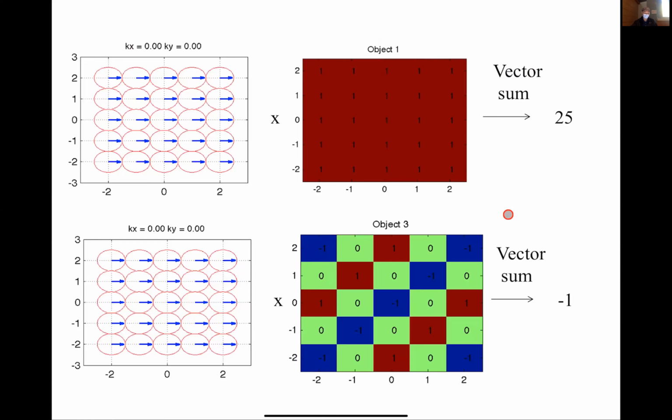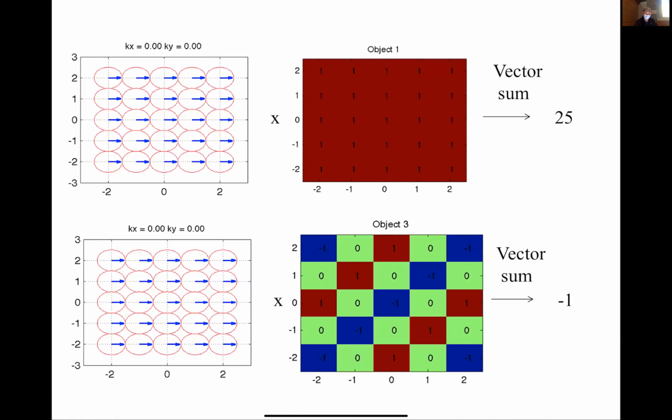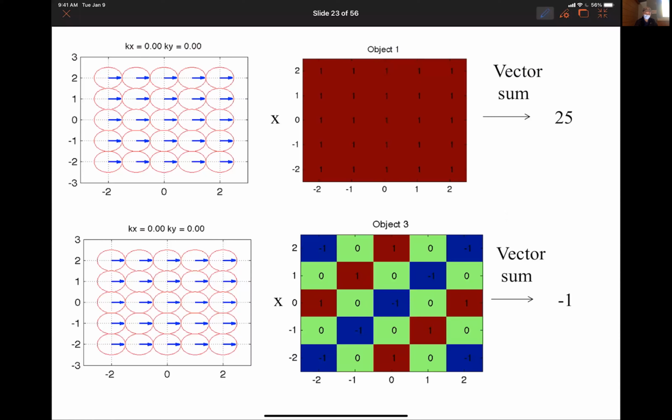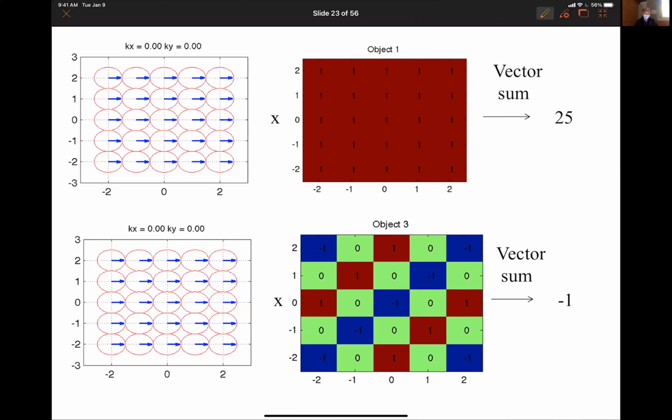So in this case, anywhere there's a -1, let me change my color here. The orange is best. Basically, wherever it's multiplied by 0, I don't have to worry about it, because anywhere it's 0, it's not going to add to the sum. So I only have to worry about where it's non-zero. All these guys are multiplied by 1, so they keep pointing in the same direction, and the ones that multiply by -1 go in the opposite direction.